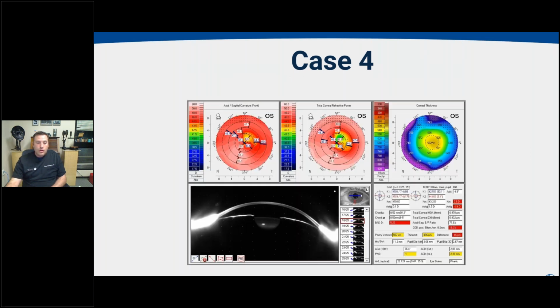So we can then look at a map that exists already, which is called the Cataract pre-op map. The one thing that this adds to the equation, which isn't on the visual performance display, is you can look and get this PNS value down in the bottom right. It's a bit of an estimate of the densitometry of the lens. So it can give you a little bit of an idea of, are you dealing with cataract? Are you dealing with some density in the lens? In this case, it's giving the densitometry of the lens a 1, which is basically very early nuclear sclerosis, but nothing major to speak of.